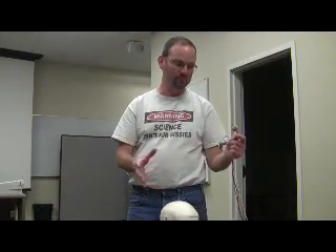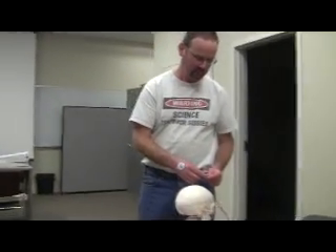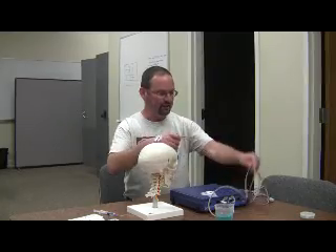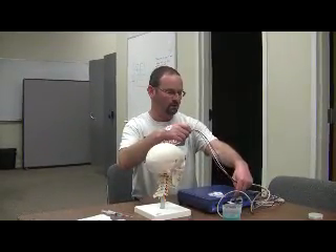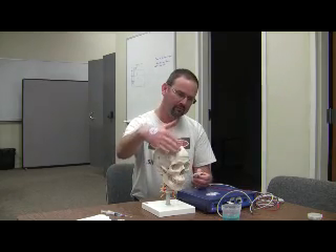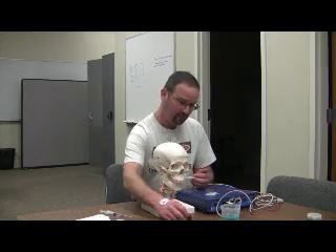I'm going to use my skull model here to illustrate the placements for one channel. This whole thing is one channel, and each connector is marked CH 1, CH 2, CH 3, and CH 4 — each one is a potential source of information about something going on in the body. Let's say we're going to use this to do the right frontal. If the skin were in place over the skull and then some hair, we would abrade the skin here. The problem with hair is that it's in the way all the time, and the abrading pad doesn't work through hair.